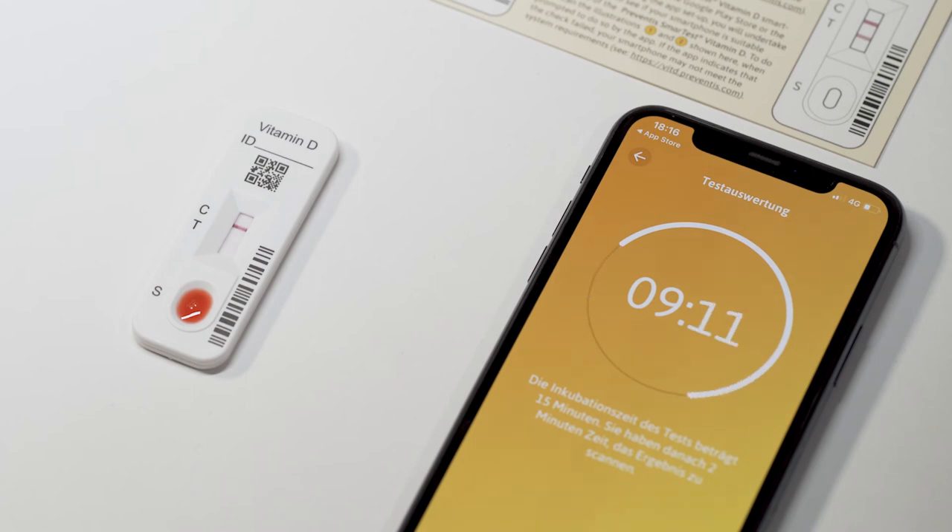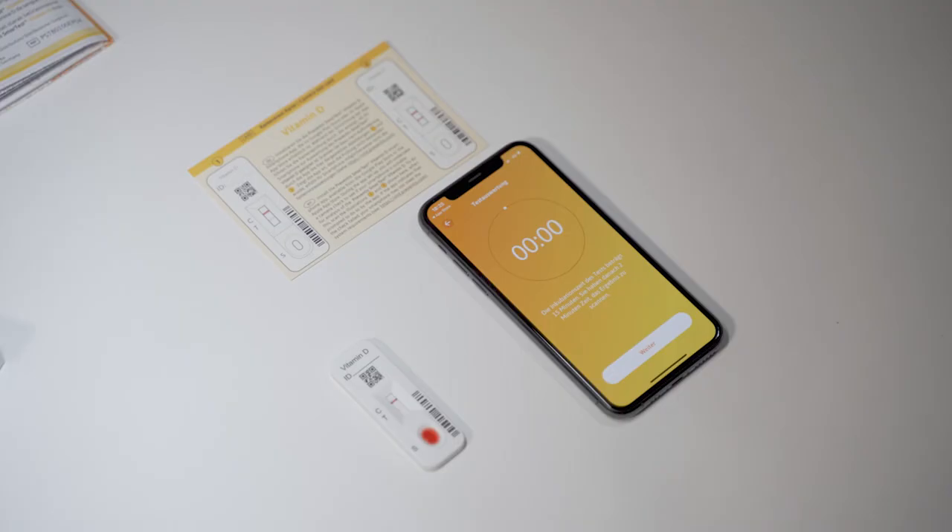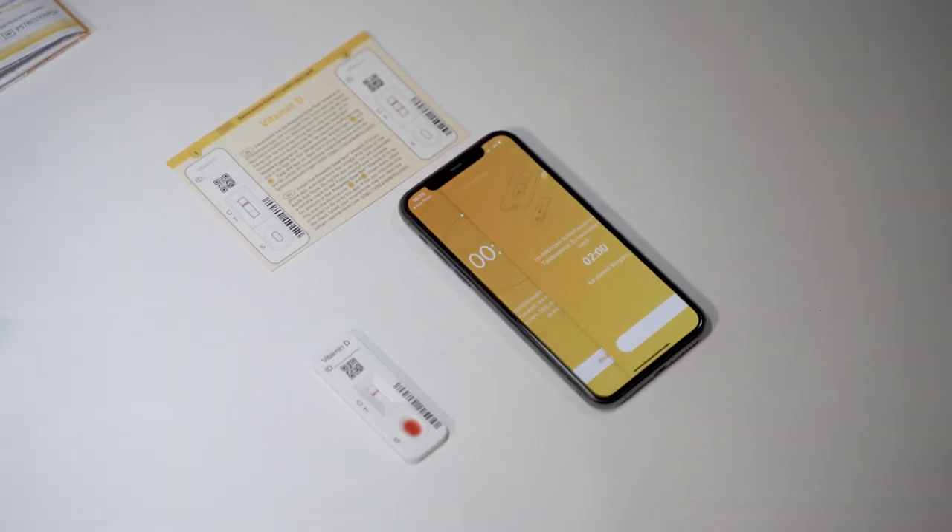First check visually whether a control band forms in the result window in area C during that time. If no control band is visible after 15 minutes have lapsed, the test is invalid and must be repeated. After the timer has expired, a signal will sound and you then have two minutes to evaluate the test. During this time, avoid shadows, strong light from the side, and direct sunlight on the test cassette. If the two minutes are exceeded, the result will be invalid and the measurement must be repeated with a new test.